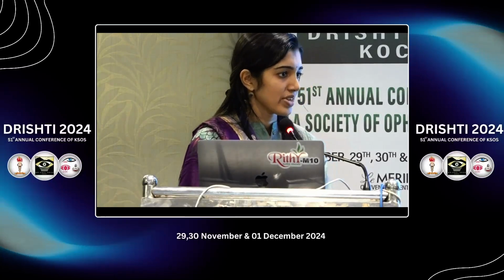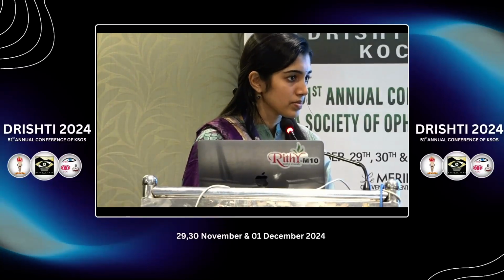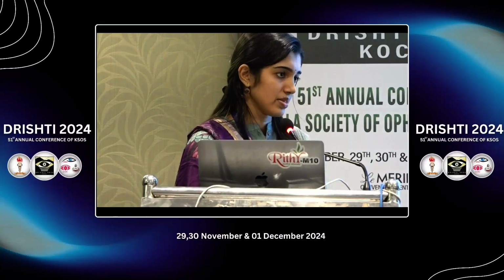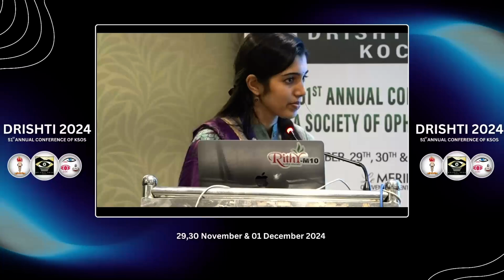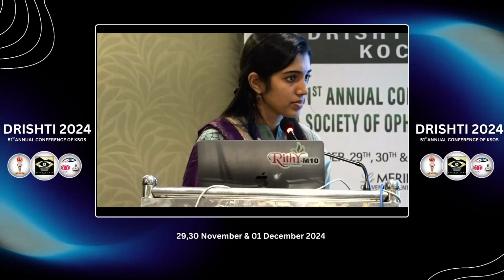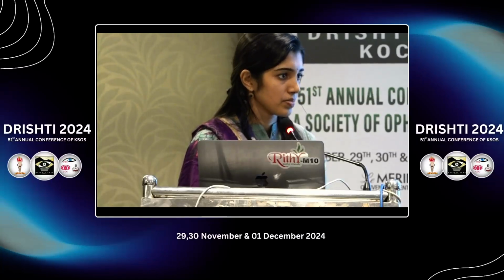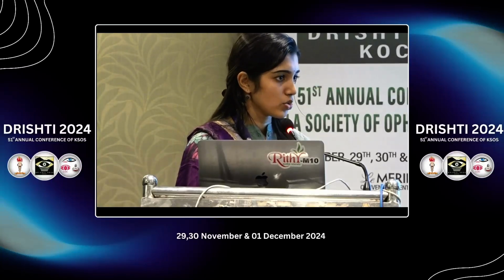For less than 2 years of age, we don't recommend a primary IOL implantation. You have to do surgery, no? Then you are telling primary IOL after 2 years. The first surgery you have done without IOL only. In the first surgery we maintain the patient aphakic and we use other optical correction like contact lens. No, you told primary, secondary IOL. Yes, sir. So the first surgery you have done without IOL. You said primary IOL is done after 2 years, why? I can't understand. Sir, primary IOL is done if the patient is aged more than 2 years. That is okay. That means the first surgery was not done before 2 years. If the surgery is done before 2 years, then we maintain the child aphakic, sir.